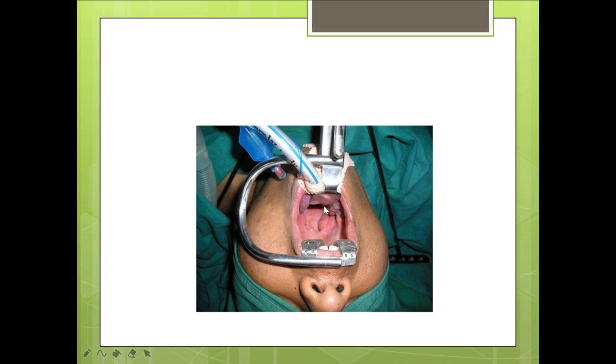See here, there are hypertrophic tonsils. Okay, what is the position of tonsillectomy? Rose's position, sir. Yeah, Rose position. So in Rose position, we place the pillow under the shoulder and the head should be down compared to the chest. So that is to prevent the aspiration of secretions from the oropharynx and the nasopharynx into the lower airway. So this is the endotracheal tube.